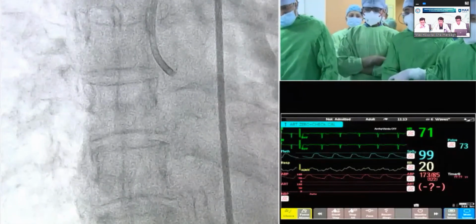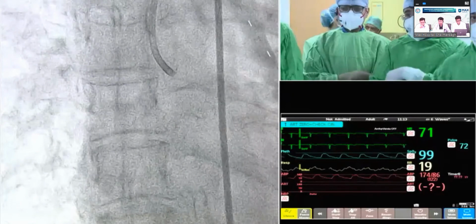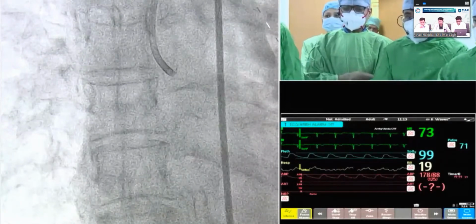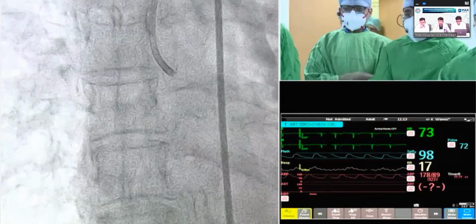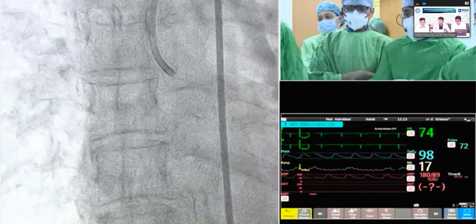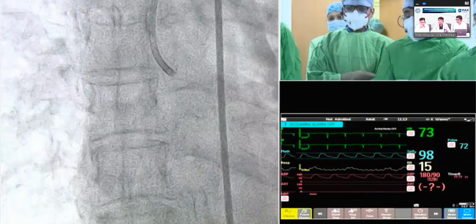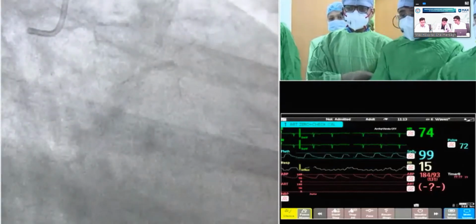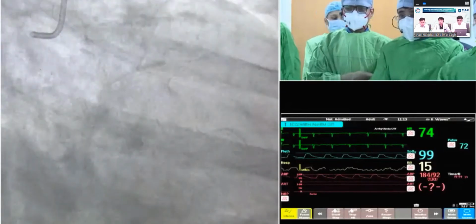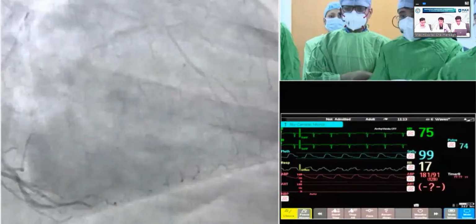So Gagan has explained the brief history of the patient. On the basis of the history, she has a calcific LAD lesion, which is a long lesion on the basis of CT coronary angio. The fluoroscopy also shows a tram track calcification in the LAD, which we can see even without contrast injection, and the calcium score is more than 600. That is suggestive of a heavily calcific lesion, because with EBCT scoring, if it is more than 400, it means a severe calcific lesion is there.